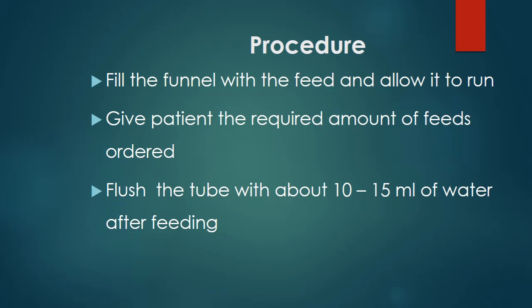Then where you are using the bolus feeding or even the gravitational feeding, we do not want air to rush through the tube and the patient's tummy will become filled with air when we are thinking that the patient is satisfied. So because of that, mostly the tube is clamped. There's that pin we use to open and close the opening of the NG tube. We call that one the spigot. The spigot is always closed.